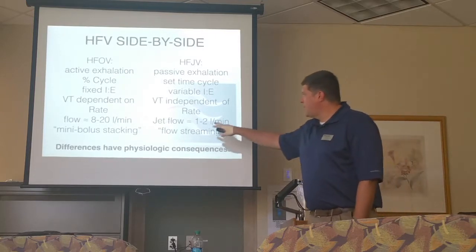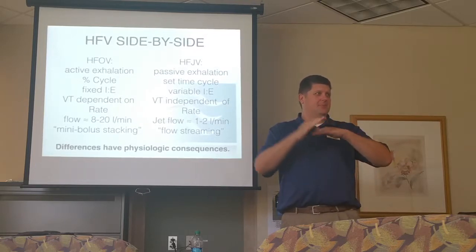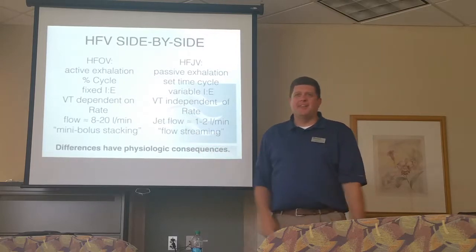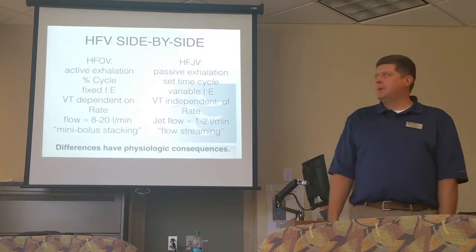There's a difference in flow rates, and I call an oscillator mini bolus stacking because as that piston pushes in and pulls out, it's like one on top of another. I haven't trademarked that yet, but I'm working on it. But that's what it is. A difference in gas delivery as well.